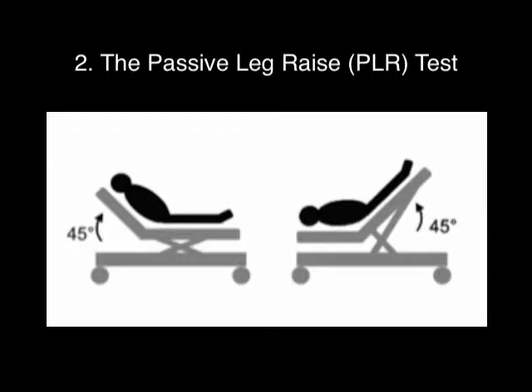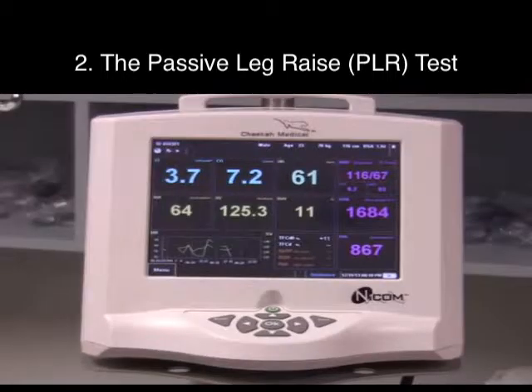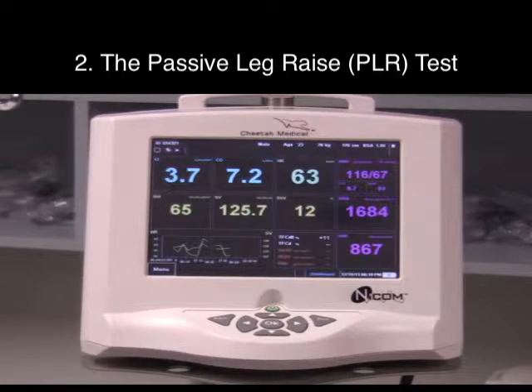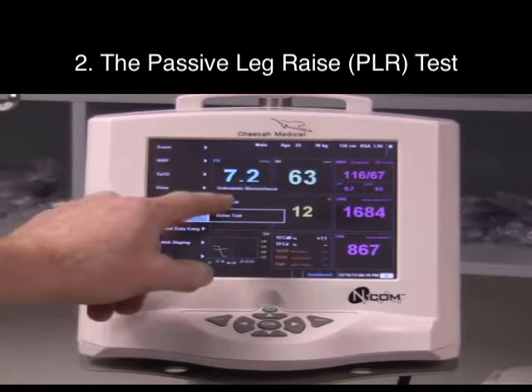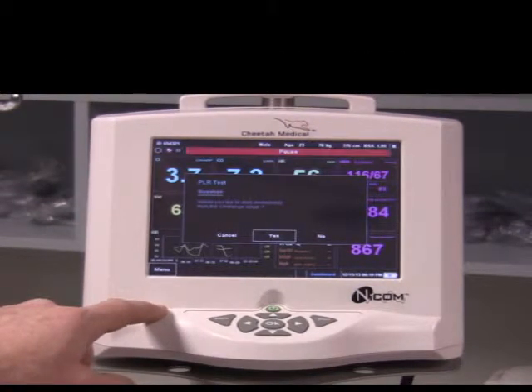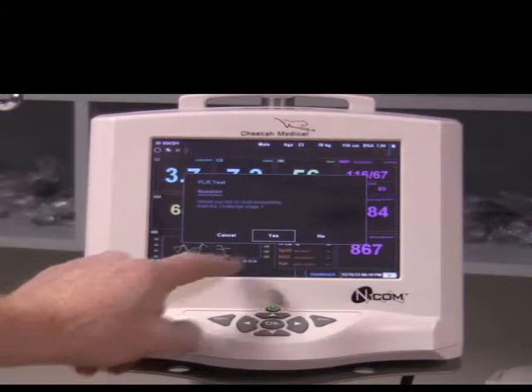A passive leg raise test can be used to assess fluid responsiveness in the perioperative period. The patient is placed in a semi-upright position with the head of the bed elevated 45 degrees. Baseline hemodynamics are collected for 3 minutes. The patient has now been in a semi-upright position for more than 3 minutes, so we'll start the passive leg raise test. A screen comes up prompting: would you like to start immediately from the challenge stage? Because we've had stable baselines for the last 3 minutes, we'll say yes.